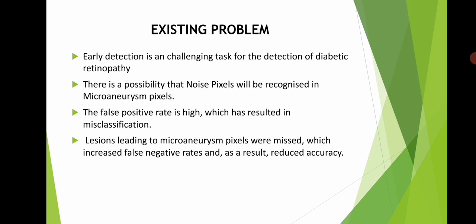existing problem. By referring to many papers, we found that noise pixels occurring during the augmentation techniques are the most challenging problem for early detection of microaneurysms. The false positive rate is also increased, which leads to misclassification.